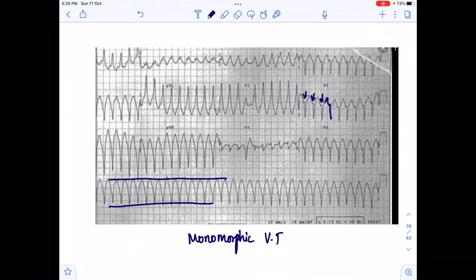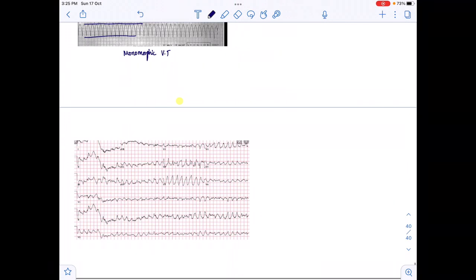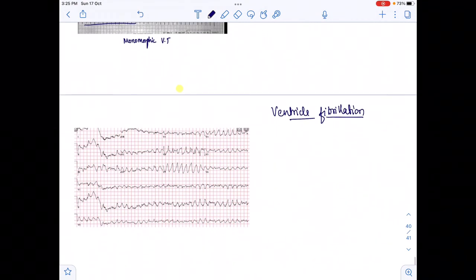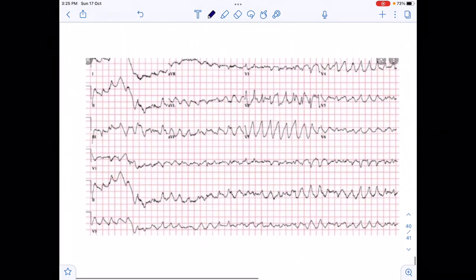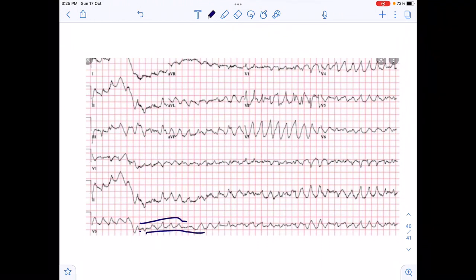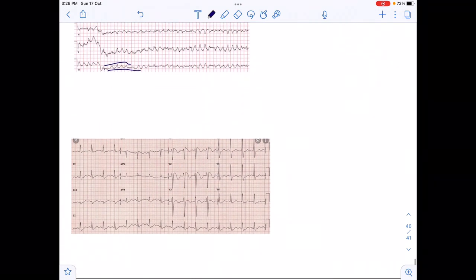In ventricular fibrillation, we do not see any organized waveform — we just see chaotic, irregular waves with no identifiable PQRST complex. This chaotic pattern on the ECG is the finding for ventricular fibrillation.